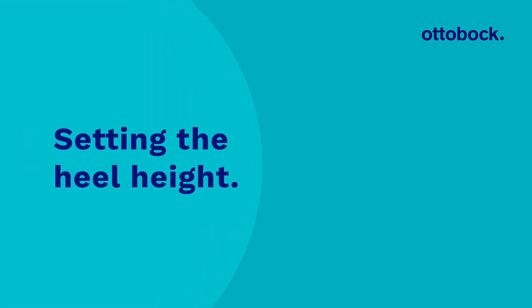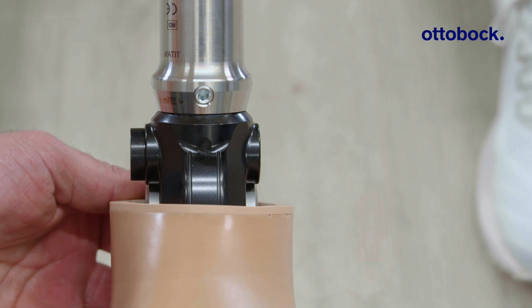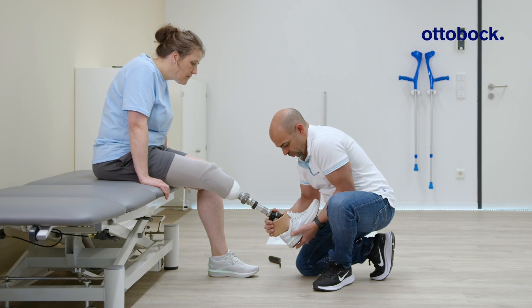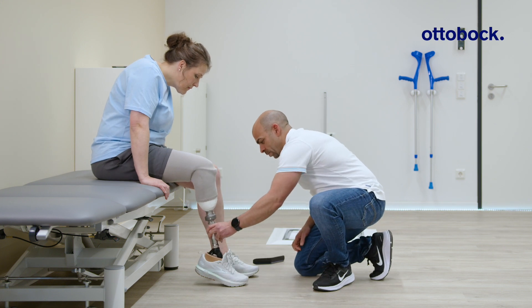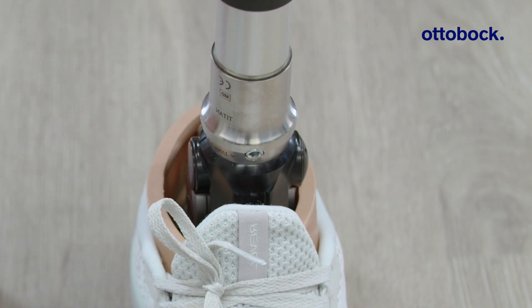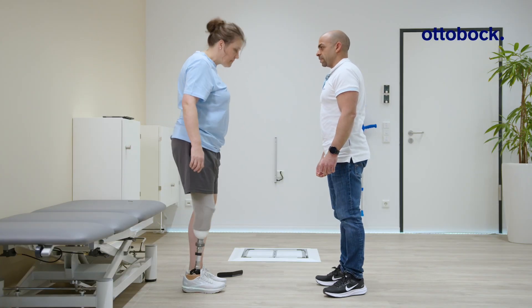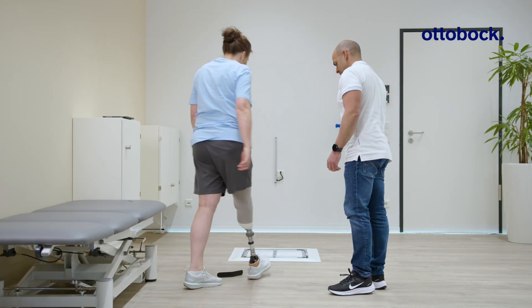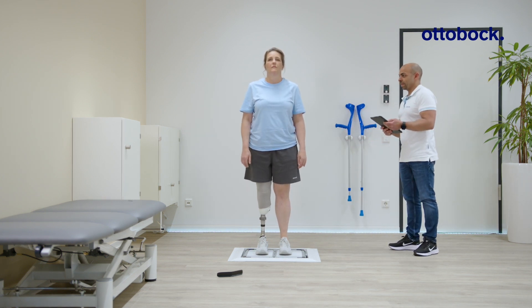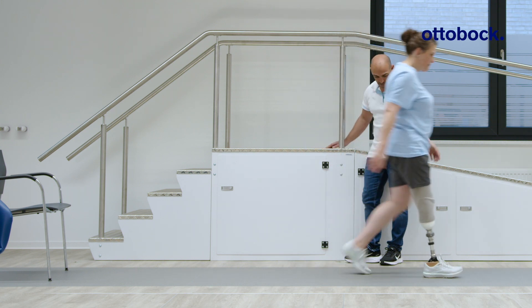Obtaining the correct alignment with shoes of different heel heights takes some practice. Begin by demonstrating correct adjustment. While sitting, unlock the ankle by pressing the button on the medial side. Put on the shoe and fully extend the foot down. Move the prosthesis back so that it is perpendicular to the floor and lock the ankle by pushing the button on the lateral side. Then have the user test the alignment while standing. By rocking gently backwards and forwards, it is possible to feel whether the foot is evenly supported. Repeat the adjustment if this is not the case. Use the 3D Lazare posture to check whether the user can set the proper heel height with the Taleo Adjust. Finally, give the user time to learn how to make the adjustment properly and test different shoes.